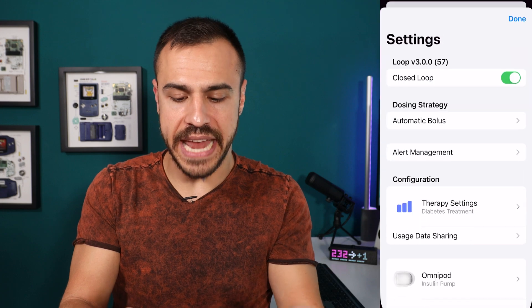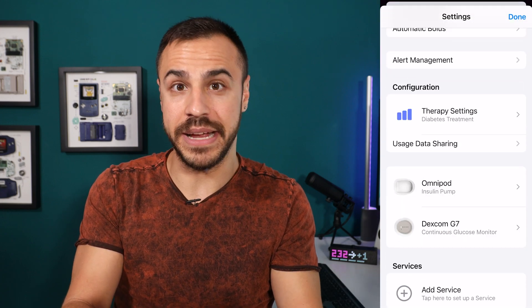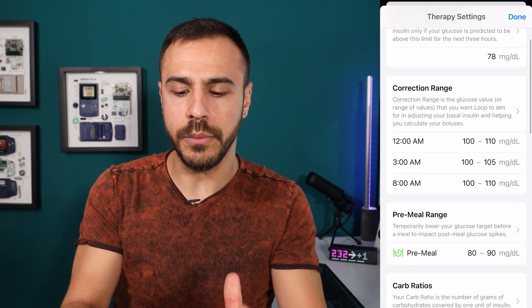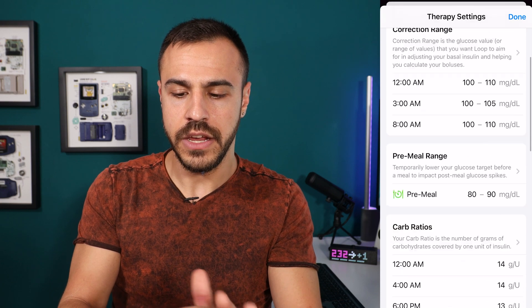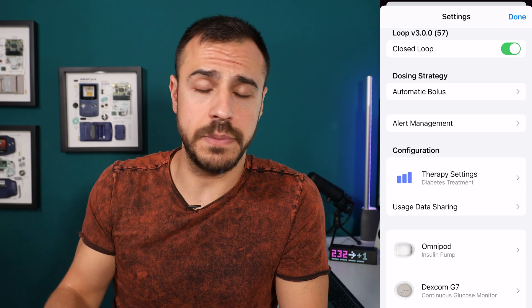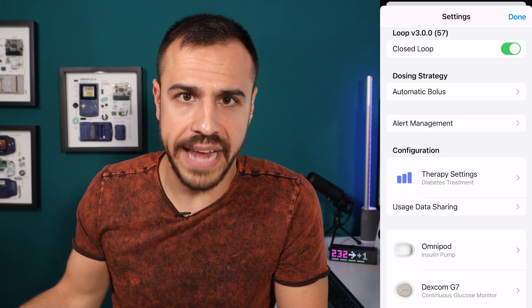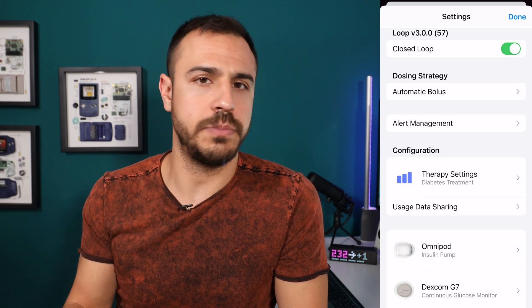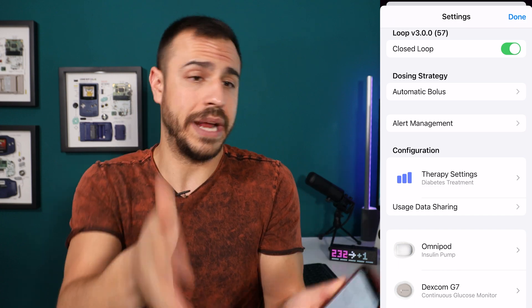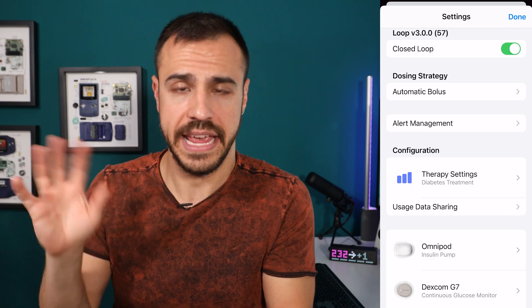That is the app. There are also settings with so much here — I have an Omnipod connected, I have my Dexcom G7 connected. You can go in and change all your therapy settings. This is definitely not something you really want to be doing only by yourself. I think you should be speaking to an endocrinologist or a diabetes educator, specifically one who understands Loop. I've heard it's not as easy as just translating your pump settings from other systems to this.